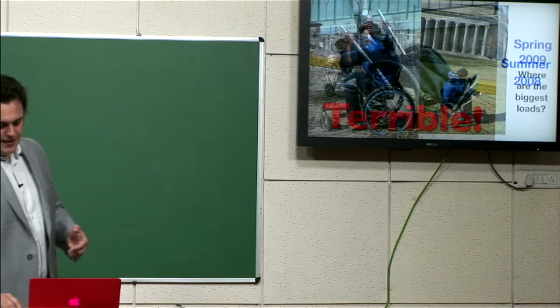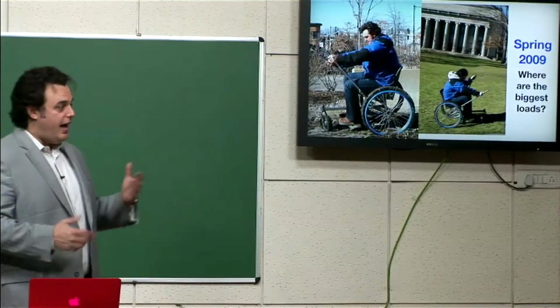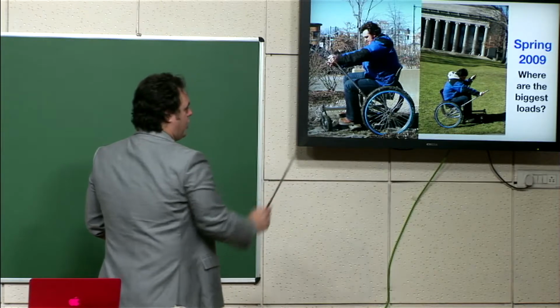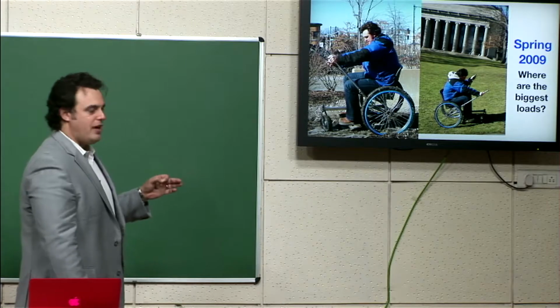So at this point, this is an interesting aside here, well, I'll talk about this product actually. After the summer of 2008, we went back to MIT, and we started thinking about how can we make a different platform that is much more usable, much more familiar to people, and actually offers better postural and seating support. And so you can see that this prototype is like a normal wheelchair. But again, this is a proof of concept prototype. Look at how rudimentary this thing is.